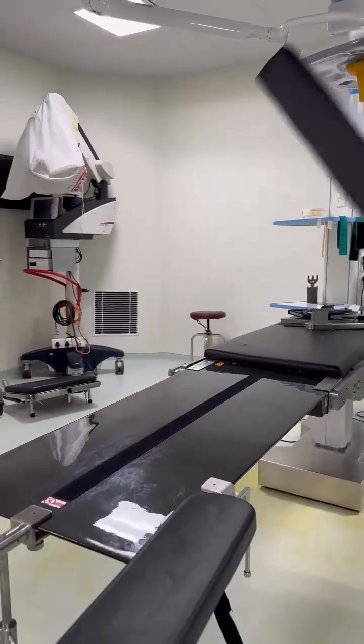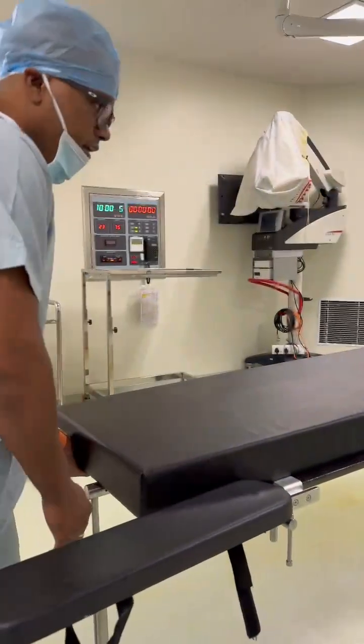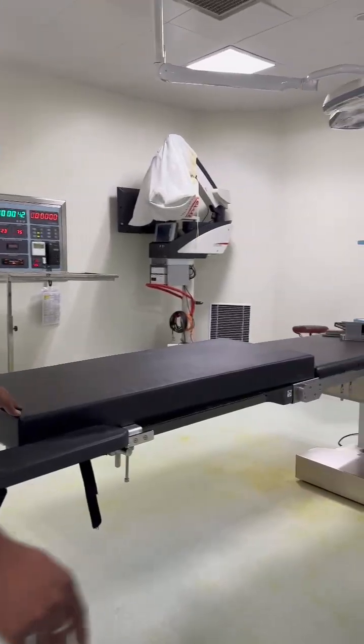Your armboard is ready. Now we have a mattress. The mattress can be placed over here, and the patient can be loaded.